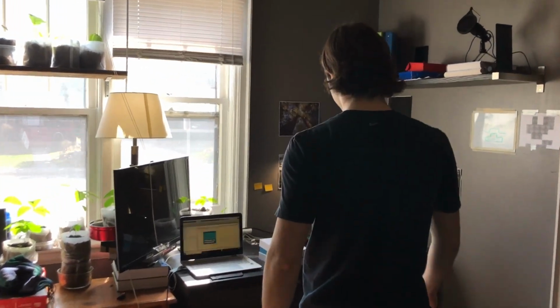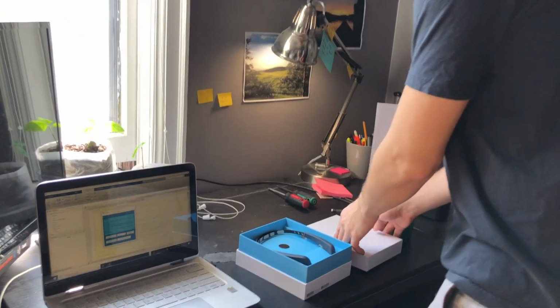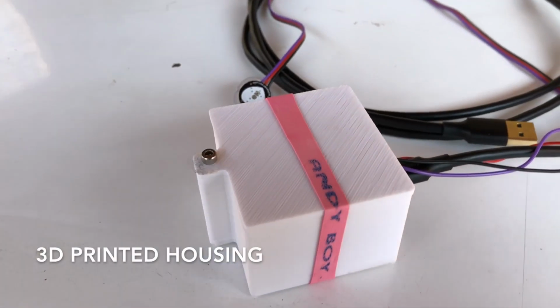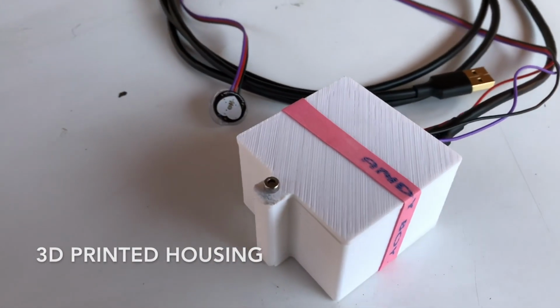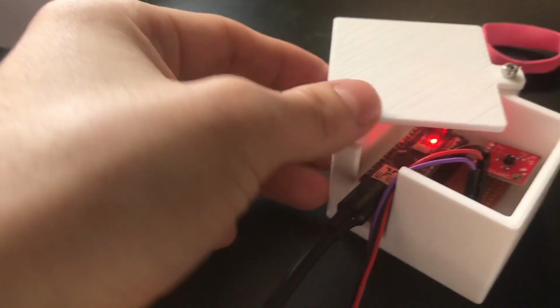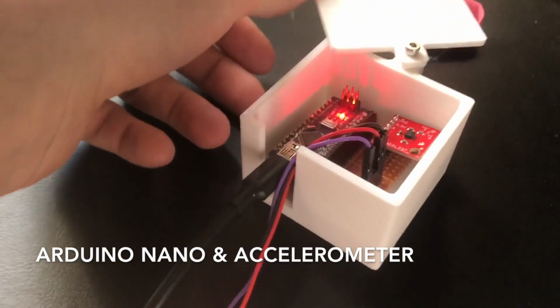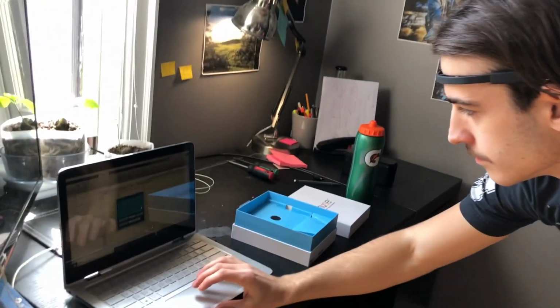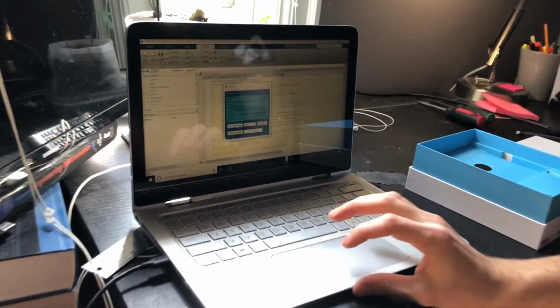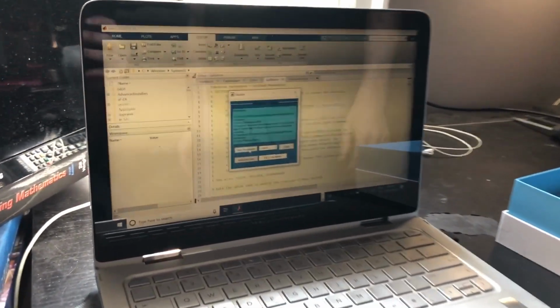Using the Muse device, we acquire the EEG data and transmit it as an EDF file through the Muse Direct cloud service. Heartbeat and motion data is acquired from a heartbeat sensor and an accelerometer. This data is then sent to a computer through an Arduino Nano. Using MATLAB, the EEG, heartbeat, and movement data is then processed to create a report on the night's sleep.